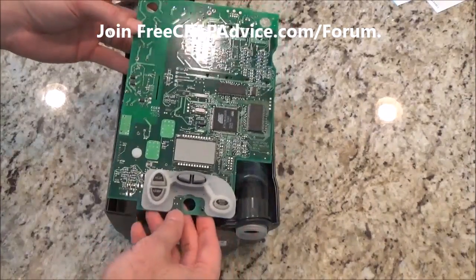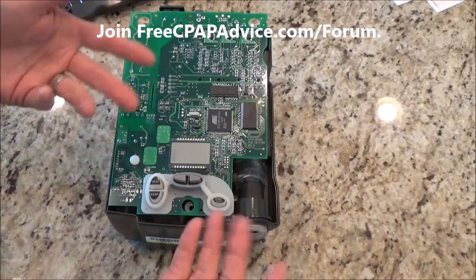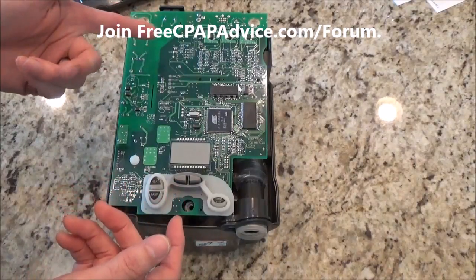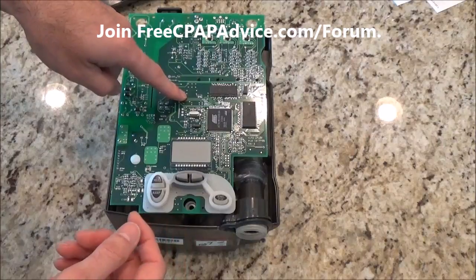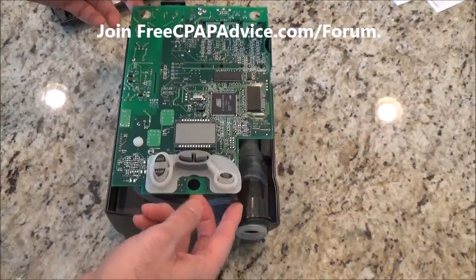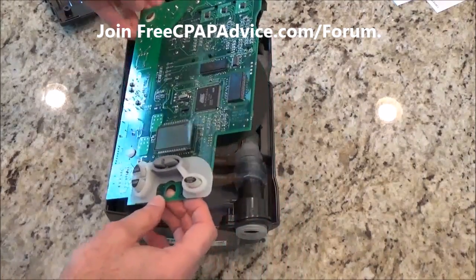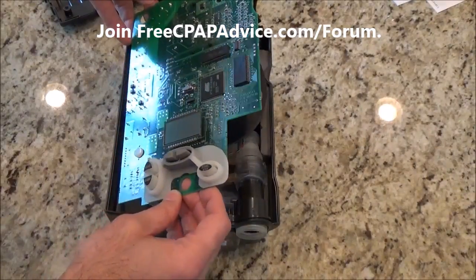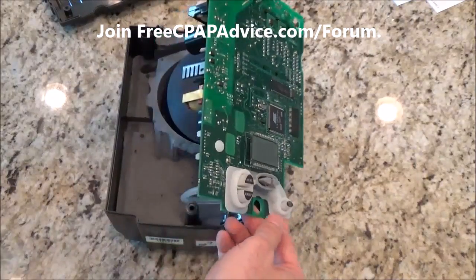When you get an error code on your machine and it says PCI board is whatever, error code 1 through like 700,000, it means this thing is jacked up. So when people ask why can't I just replace it or get it repaired, it's this that needs to be repaired. And if your machine costs $1,000, this thing accounts for 990 of those dollars. So you might as well just get a new machine, is usually the answer.